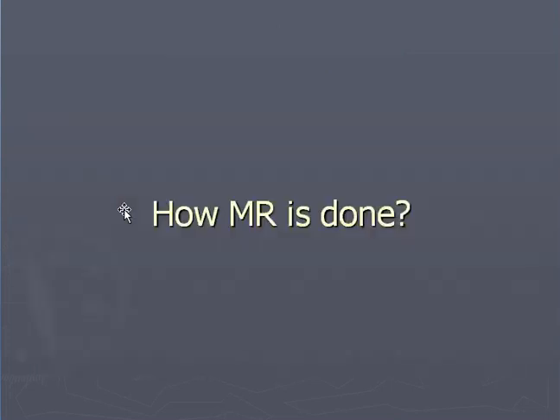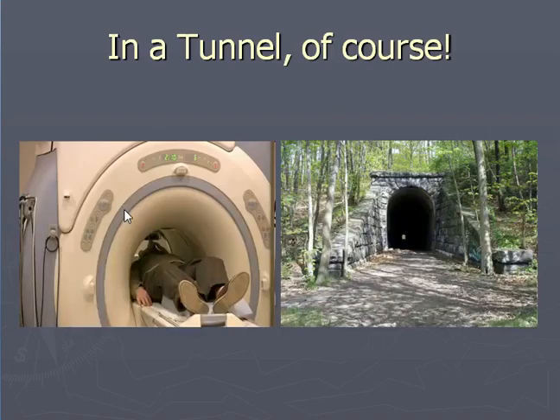Now we want to see physically how the MR is performed. This is a tight bore, an example is given as the tunnel on the right of your screen. The patient has to go through this tunnel, which is like 5 to 6 feet long and 2 to 3 feet wide. So this is why some patients feel claustrophobia.